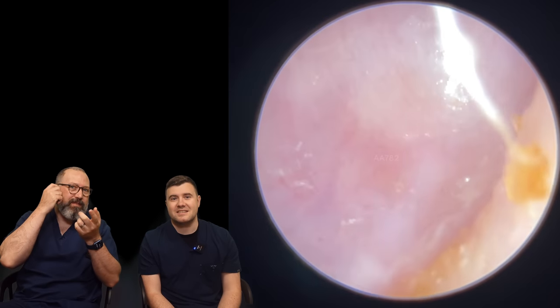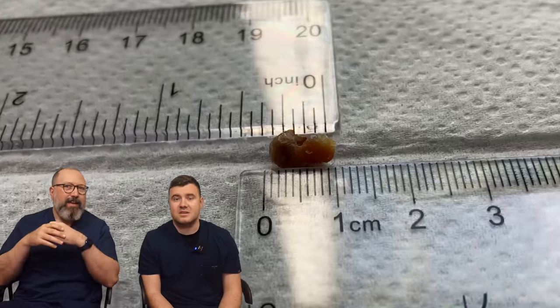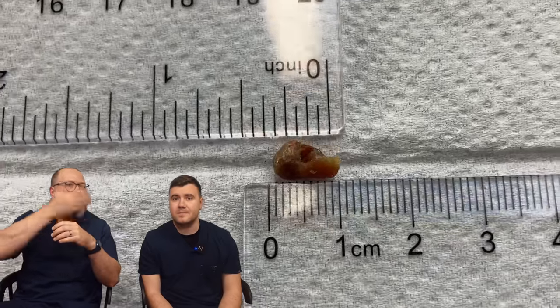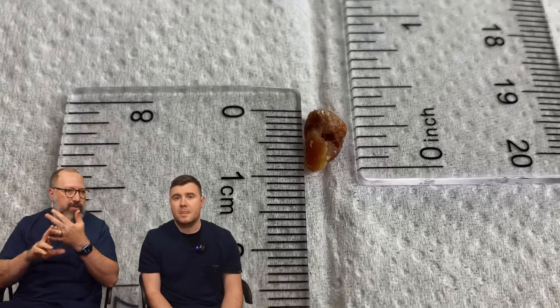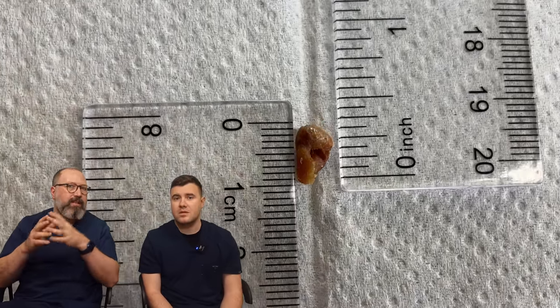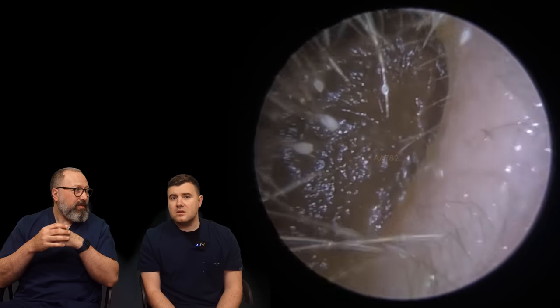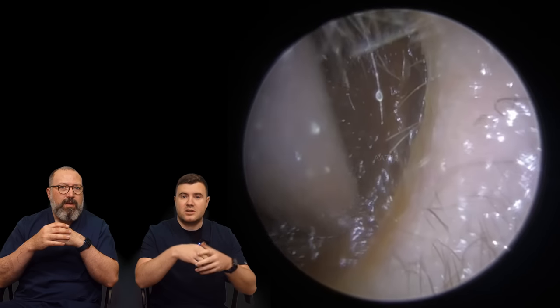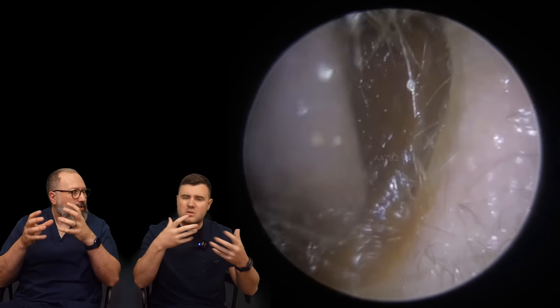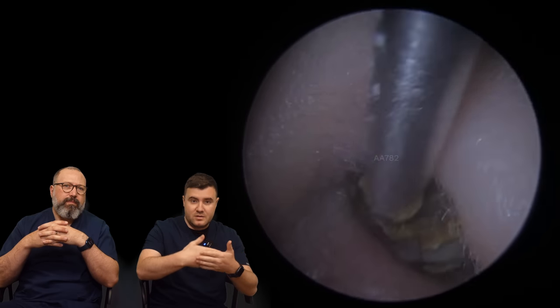I had a lady come in yesterday who I think had a false fundus. That looks like a false fundus — there's no sort of eardrum markers there whatsoever. Couldn't see any handle of the malleus, couldn't see any light reflex, nothing there. So I think that's a false fundus, and they do come like buses. The false fundus, I think, forms from where people have continued issues with infections in the ear, or damage to the canal wall skin. It's basically a second eardrum that forms in the middle of the ear canal, so the actual eardrum is usually behind the false fundus.